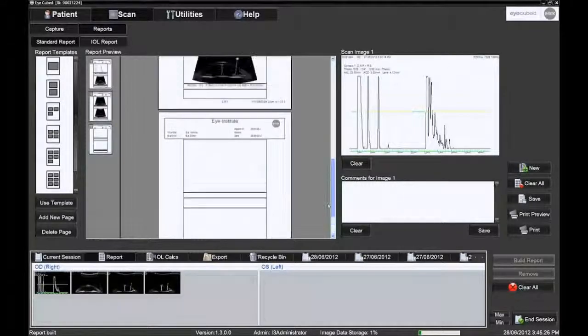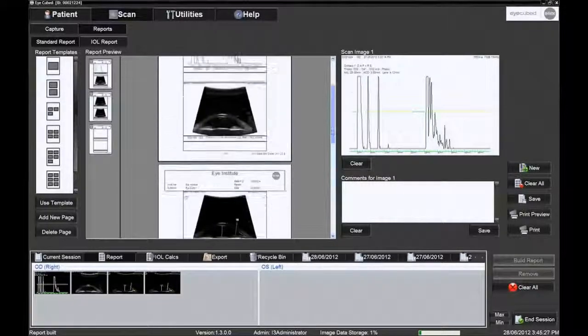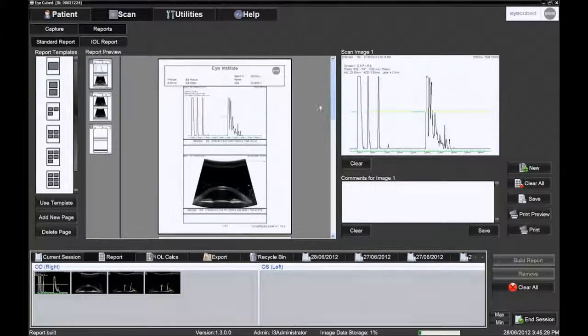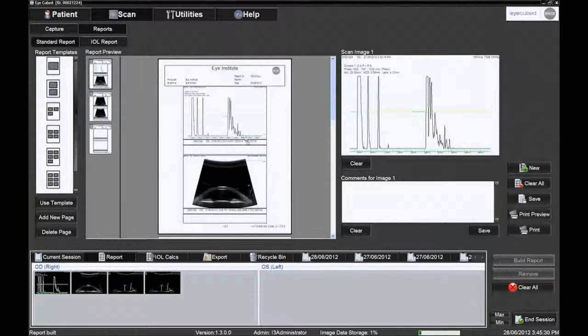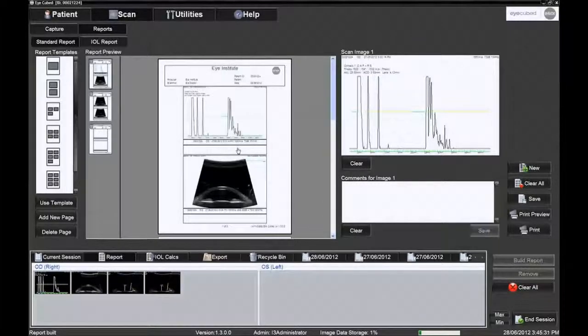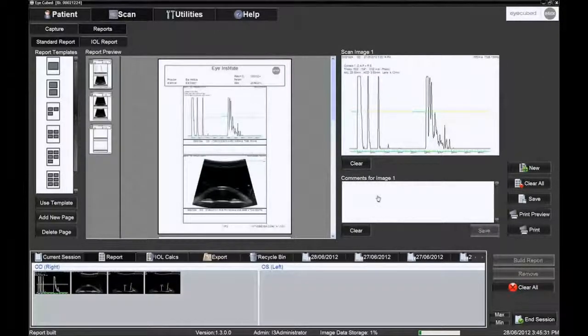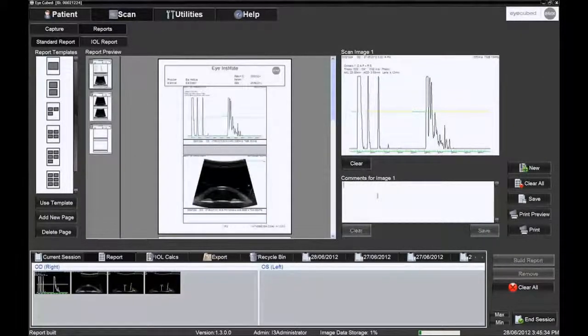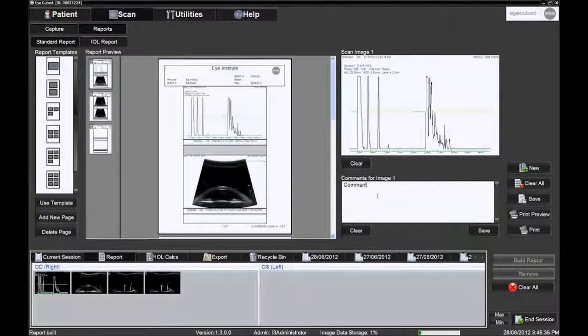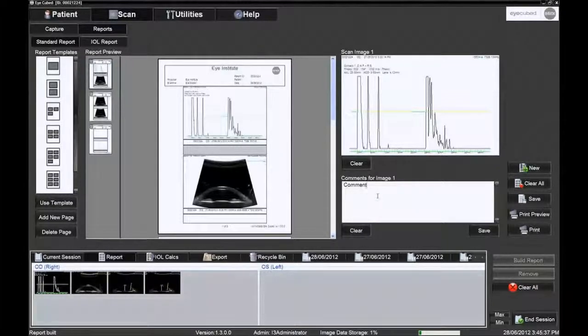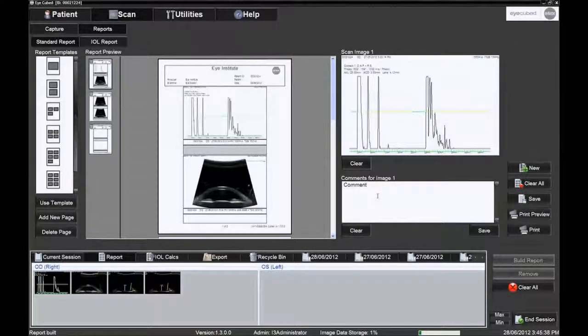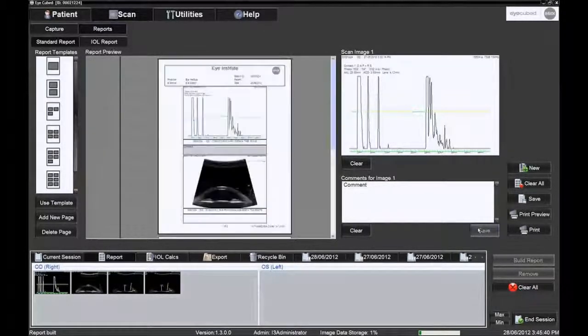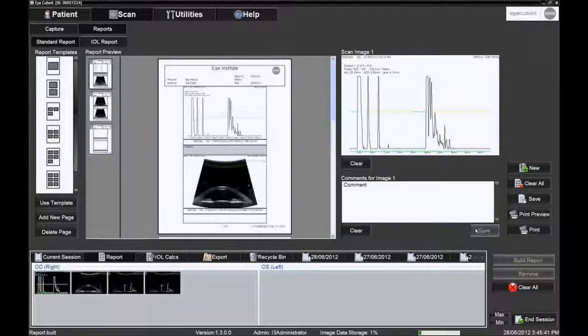Note that some templates allow for an interpretation to be typed into the comments box to be shown below each image in the report, while other templates use a single common text box. After completing each comment, click the Save icon to the right of the text box.